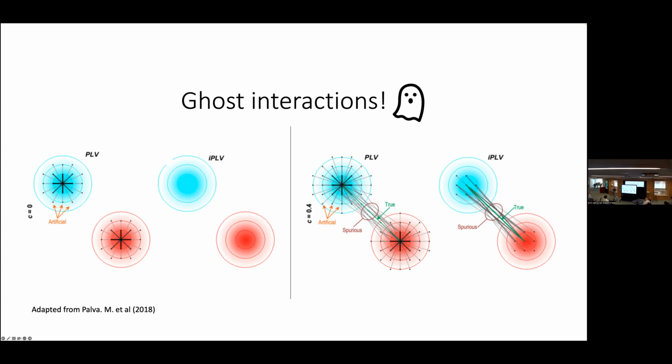So these problems with source mixing, you can deal with them, and there are ways to make them better, but you're never actually going to completely remove the problem. And this has an impact on our spatial resolution. So in general, this means that MEG is not really the method you would use for a region of interest study where you're focused on specific locations. But it's really good if you're interested in large-scale dynamics, where the exact position of the source is not the main interest.